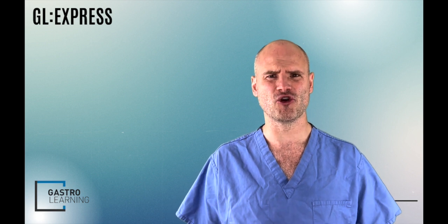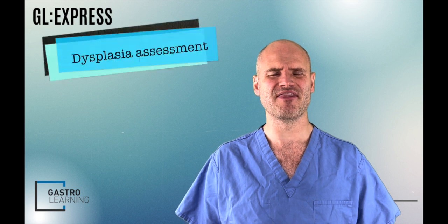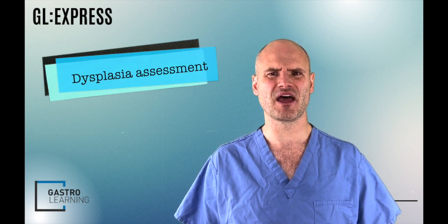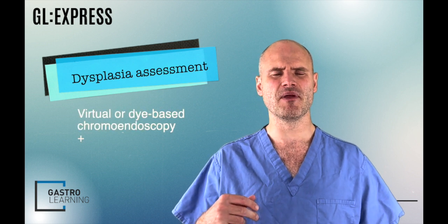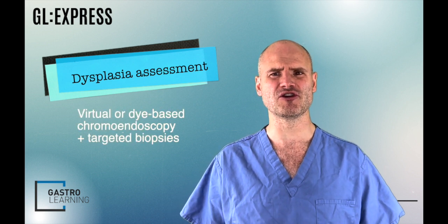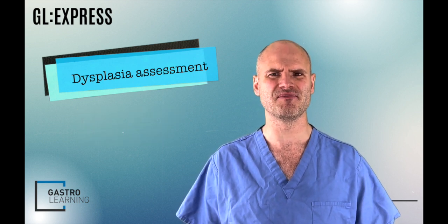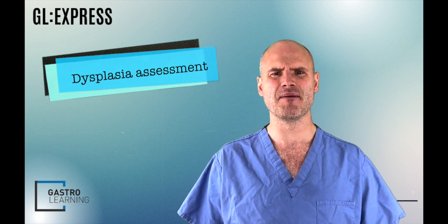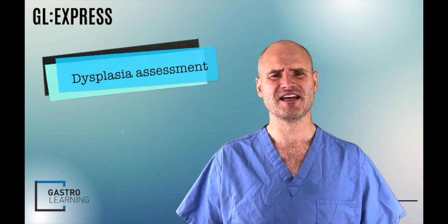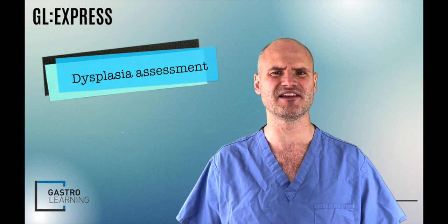Like in all areas of endoscopy, the use of high definition and image enhancement endoscopy is recommended, and these guidelines also suggest that we use virtual or dye-based chromoendoscopy. They suggest that dye-based or virtual chromoendoscopy in combination with targeted biopsies should be used in patients undergoing surveillance in IBD. And in these patients who have had long-term IBD and are undergoing regular surveillance endoscopies, they suggest that a neoplastic lesion should be detected in more than 8%. That's our detection rate for neoplastic lesions should be above 8%.